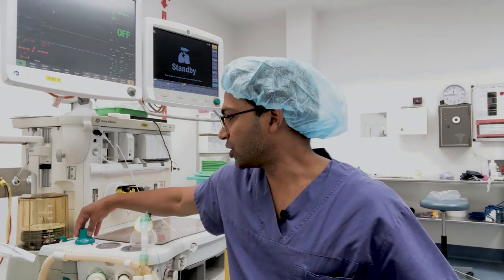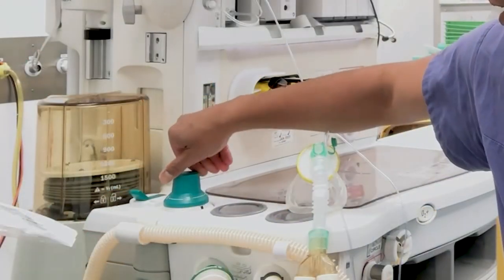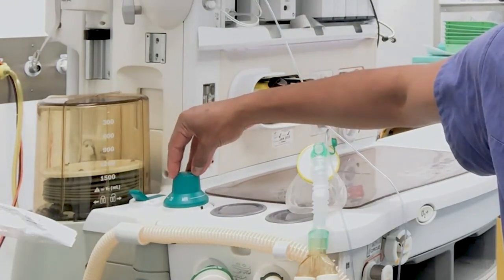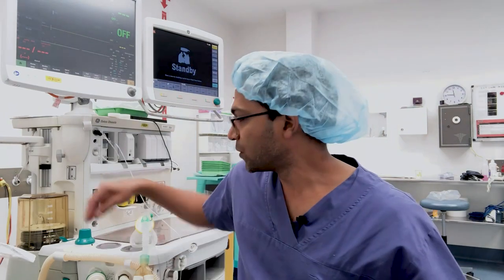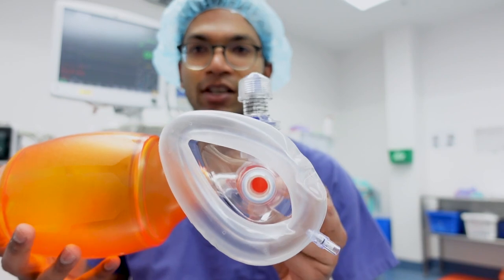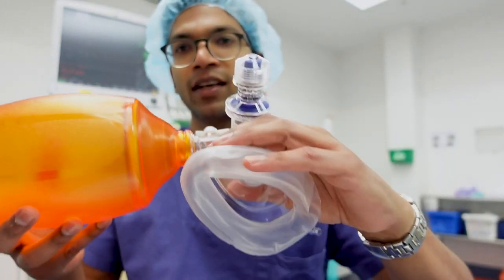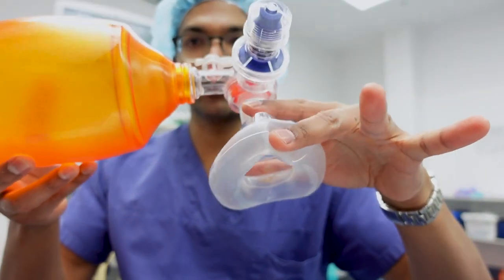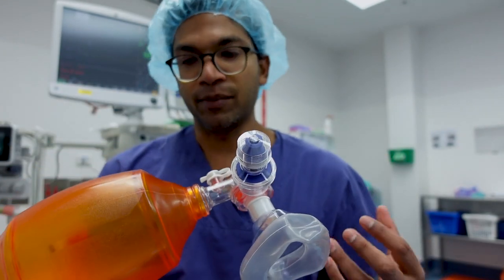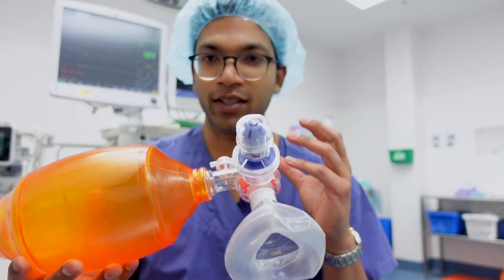In my anesthetic machine, this function is the APL valve, which allows me to change the pressure whereby the circuit blows off air — I'll often change that as I'm bagging a patient. With this mask, I can't do that, so I have to be really in tune with the patient. If I feel like there's too much pressure in the circuit as I'm holding the mask on the patient's face, I can just let air escape if required, which means I'm going to avoid barotrauma.